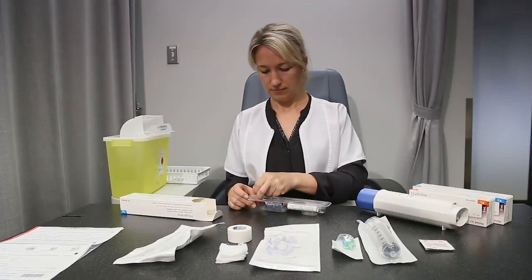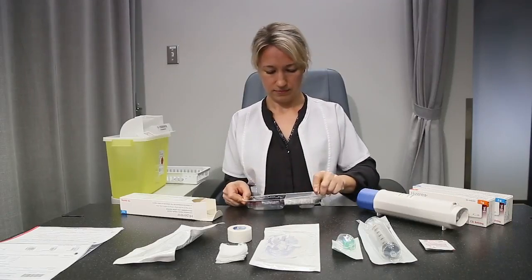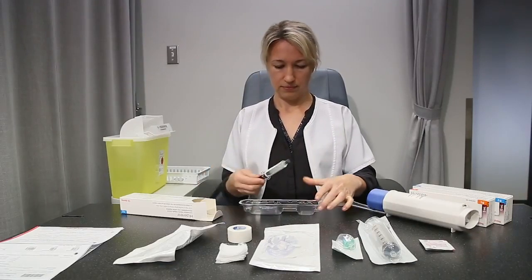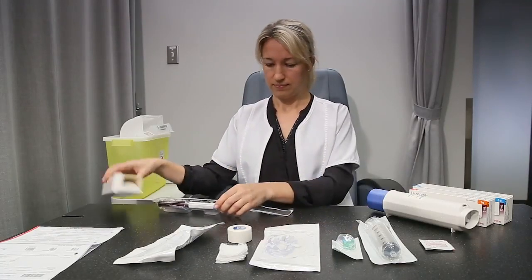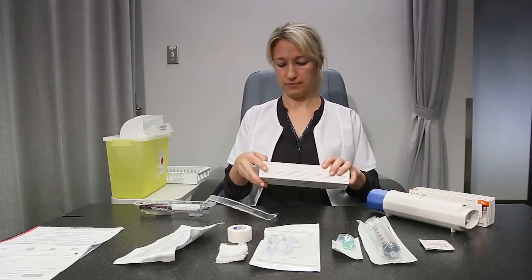Remove the plastic wrap covering the syringe tray. All the syringes should be inspected individually. Locate the lot number stickers and verify the expiry dates. Inspect the product and the syringe — the product should be clear, non-cloudy, and free of particles.